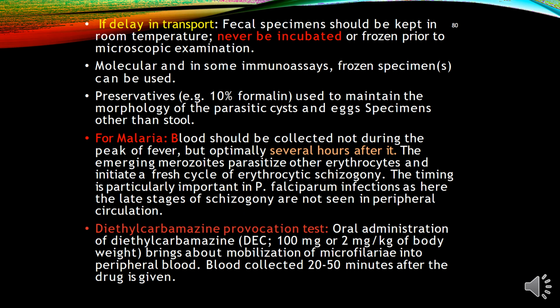If delay is expected, the fecal sample should be kept at room temperature, never incubated or frozen prior to microscopic examination. Molecular and some other assays of frozen specimens can be used. Preservatives like 10% formalin should be used to maintain the morphology of parasitic eggs and other specimens.